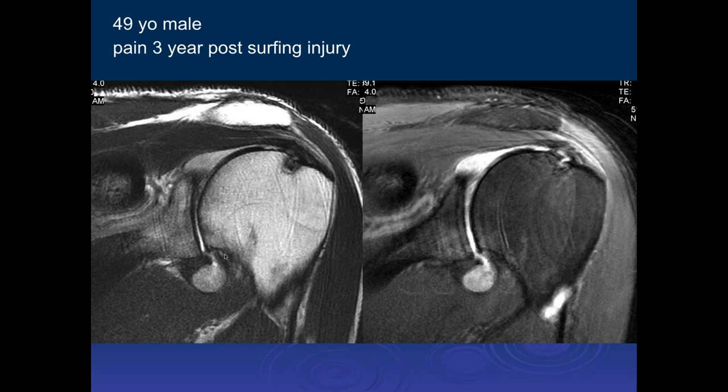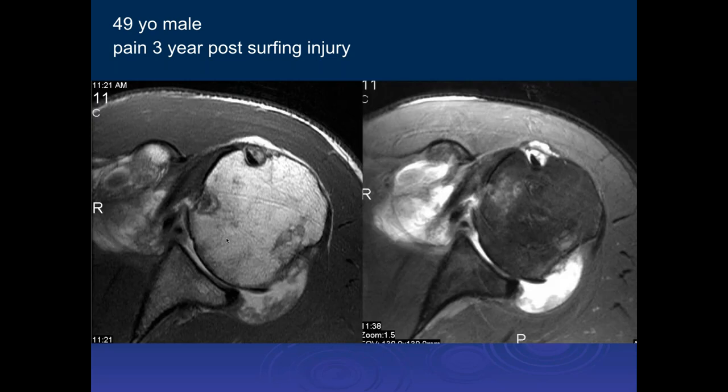So it's a little bit of degeneration of the glenohumeral joint. There's not a lot of synovial thickening, or maybe minimal synovial thickening. Some synovitis at the axillary pouch and at the superior capsule. Yeah, this is all synovial thickening. I'm pretty sure this is a T1 weighted image. And we can see a little traction cyst there. Maybe some cartilage thinning here and a little osteophyte.